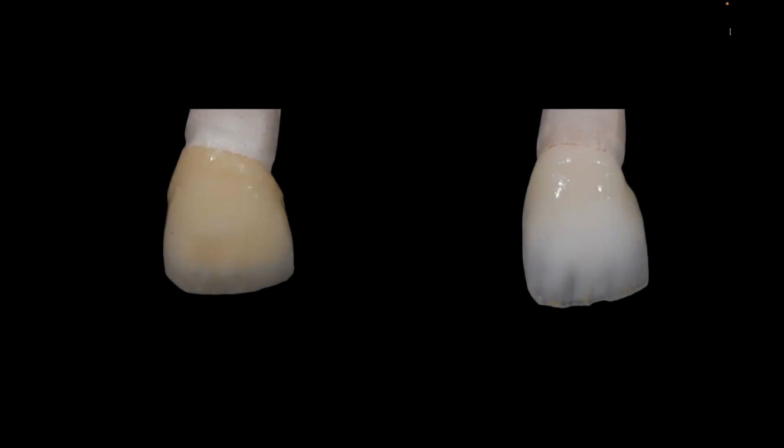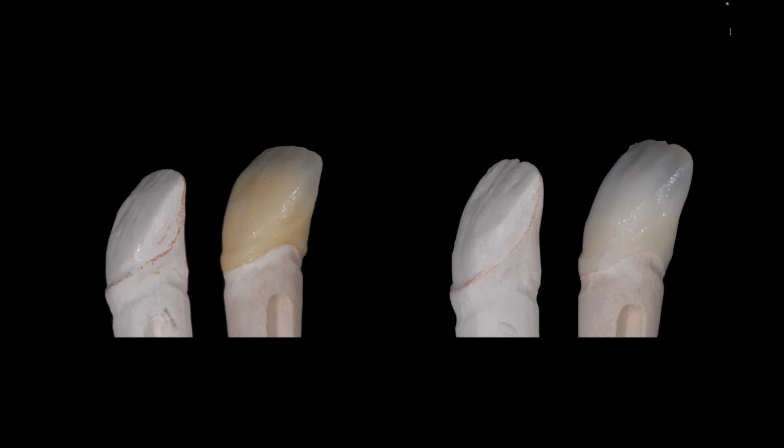So years ago, I did this experiment where I actually made these two different colored dentin crowns, and then I took all the enamel off them. So you're looking at just dentin built up on refractory dies. And what I did was I came back and I said, I'm going to make veneers over those that are only going to be 0.2 to 0.5 of a millimeter. So they're just pure enamel type veneers.